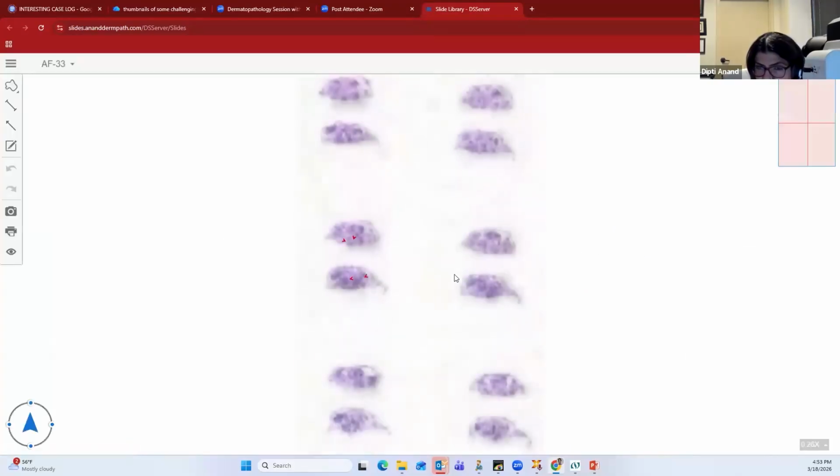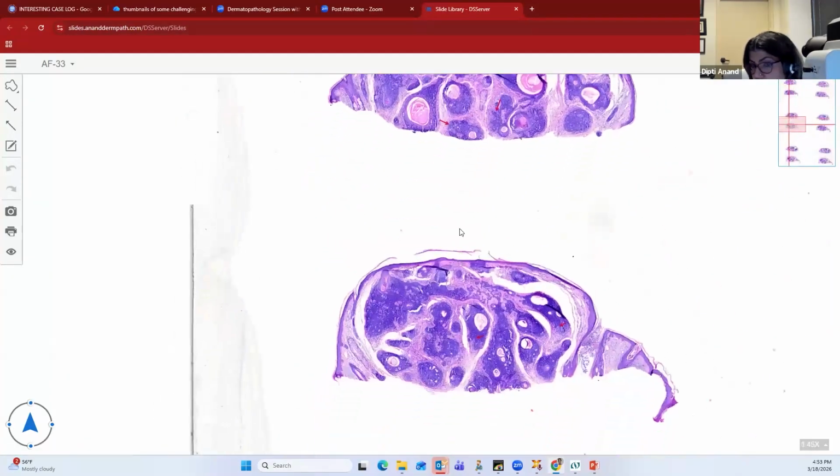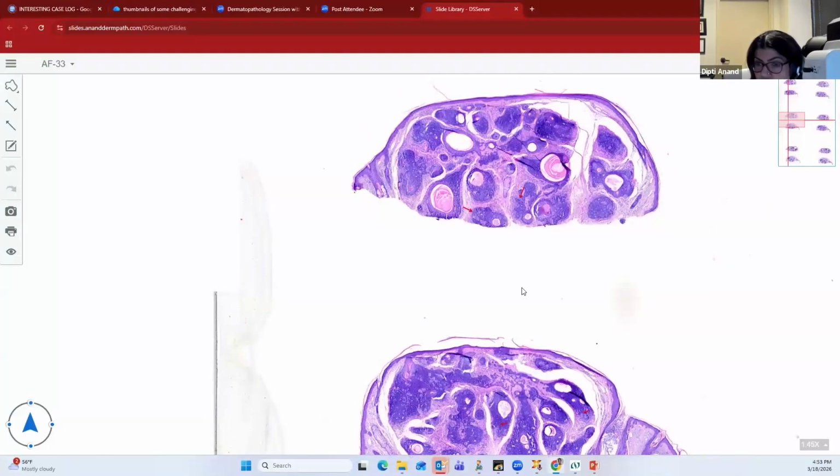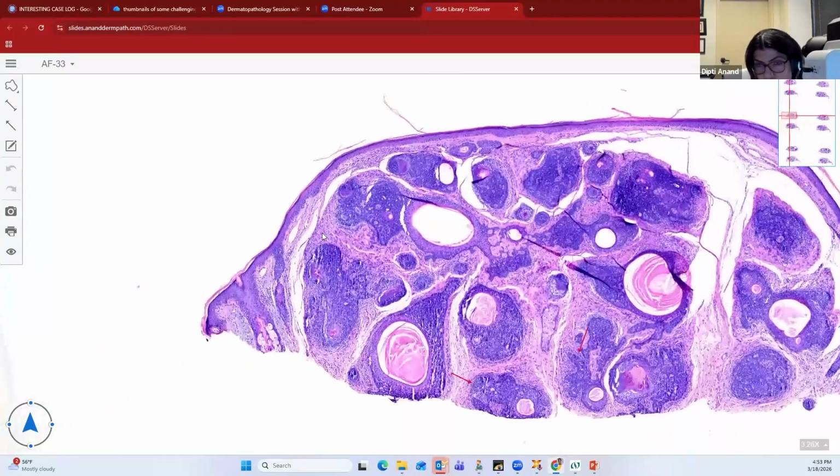So in a trichoepithelioma, it's the prettiest looking of all the follicular tumors and the closest differential of a basal cell. An important thing about the trichoepithelioma is that the stroma is an integral component of the lesion, and you often see stroma to stroma retraction. So you can see the nice retraction of the stroma from the adjacent tumor, whereas in a basal cell, you get tumor to stroma retraction. Here you get stroma to stroma retraction.